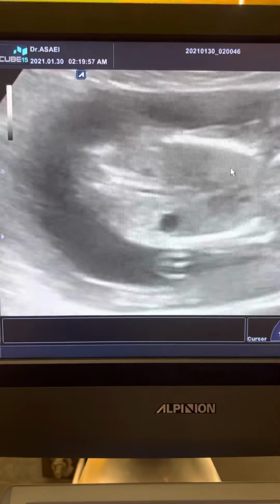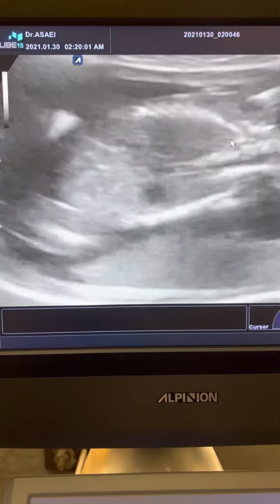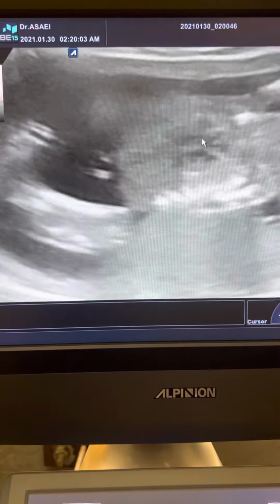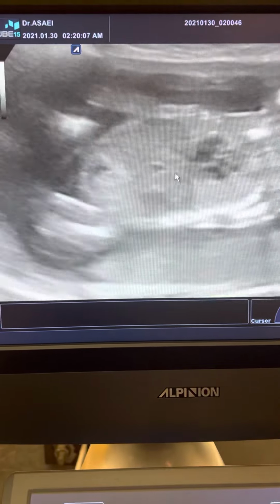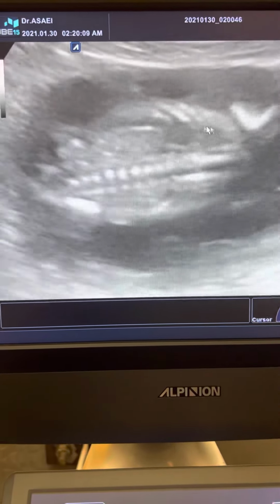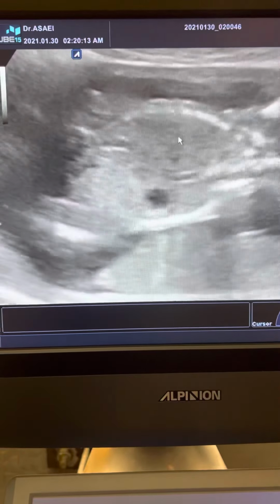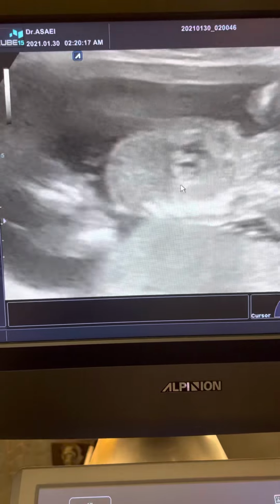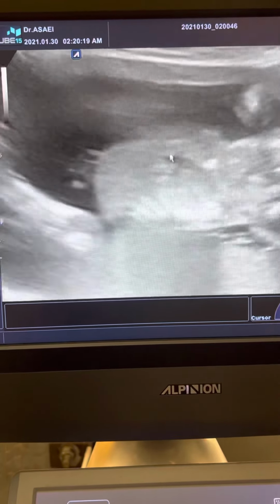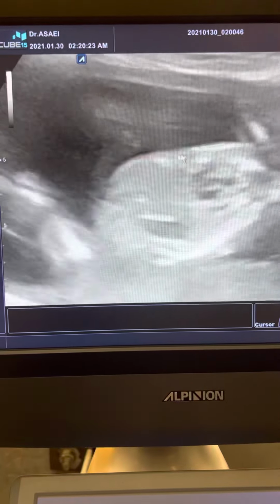Everything is okay. We'll look at the chest area also, not to be any mass or shifting of the heart or any changing in the echogenicity of the lung or any liquid or effusion in around the heart or also around the lungs. So everything is clear here.